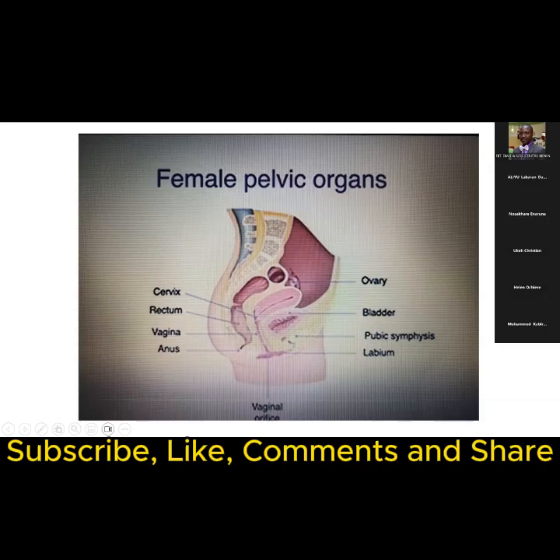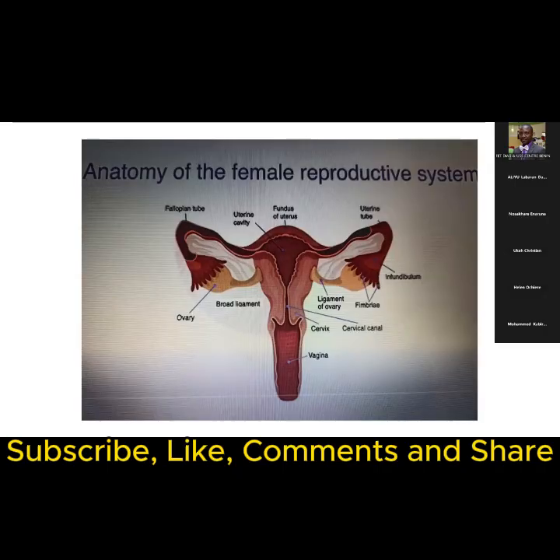The same thing goes with this. You're looking at the uterus, the cervix, and the vagina in the middle. And on the adnexal structures, you should appreciate the ovary and the tubes. It is particularly important to note that the ovary is usually located below, that's posterior to the tube.